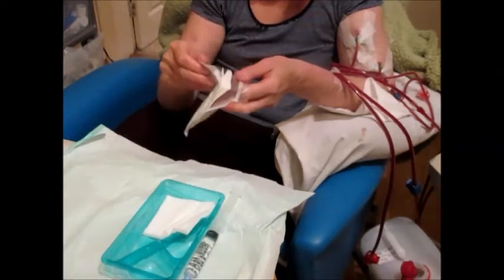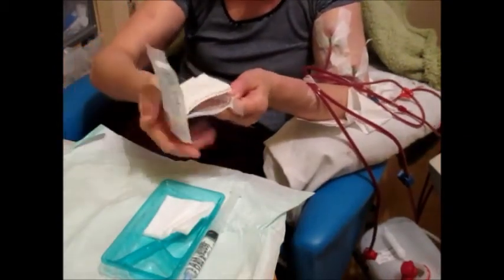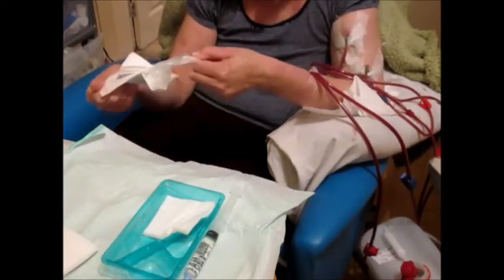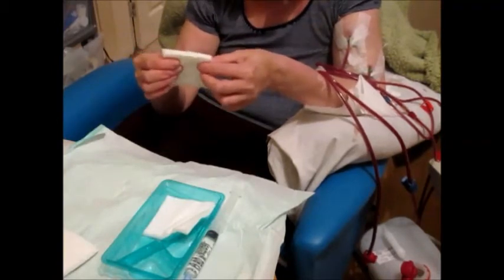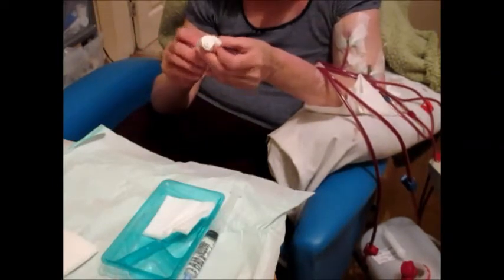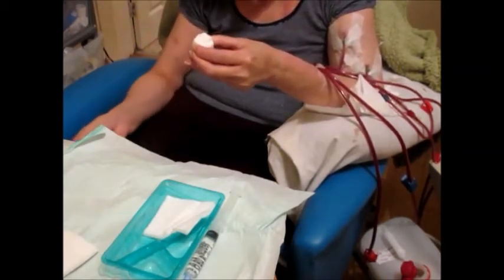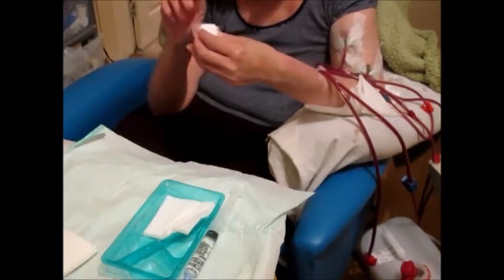If I was in a clinic setting, I wouldn't be using the saline that I had there ready for emergency use throughout treatment, but there's no harm in using that saline. In many ways, it's actually better to use that saline that's been sitting there with the sealed rinse connector, because the saline down there has been sitting there exposed as well with the connector which is actually open — so I just prefer to use what's already ready in front of me.